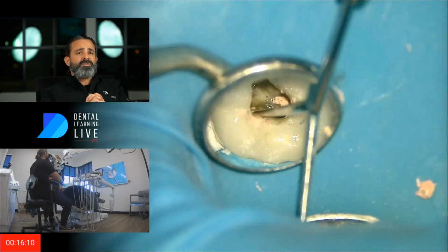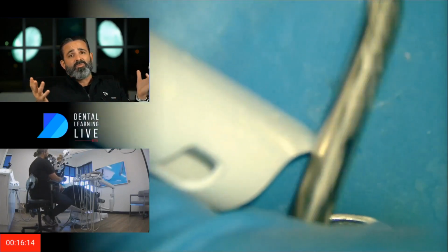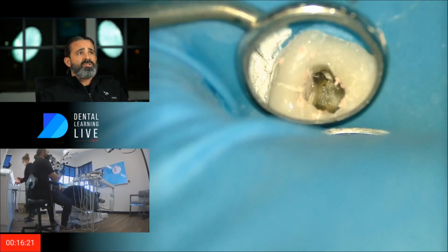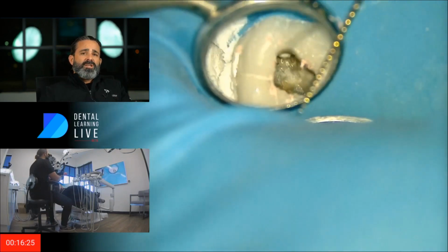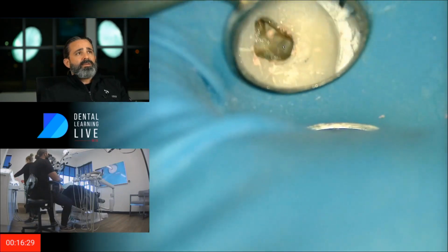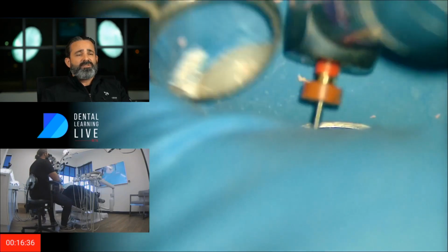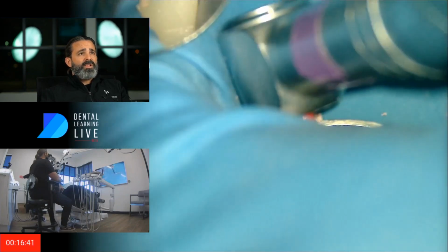I don't want to enlarge it. It's already enlarged enough. By a lot of definitions, and by my definitions of today, it's too large. But it is what it is, and it's already there. So I'd rather wick it out more than enlarge it to get it out, which is a different skill set under a different mindset. I think a lot of us started out our careers where we just enlarged it and kept going because it was more efficient for us. Now I think different. So I cleaned it up a little bit.